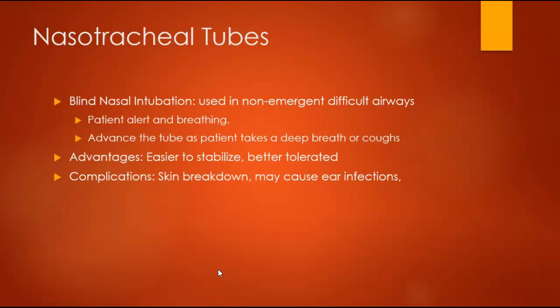The patient's awake during the procedure so that they're controlling their breathing, because if they get sedated for intubation, we knock out their drive to breathe, we paralyze them, and then we're solely responsible for ventilation.